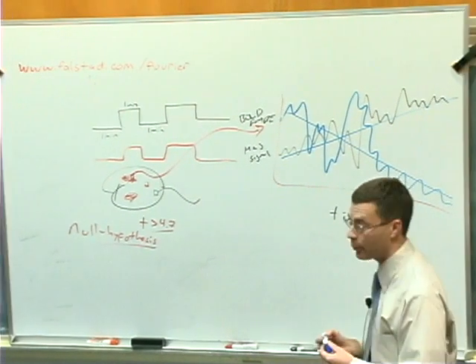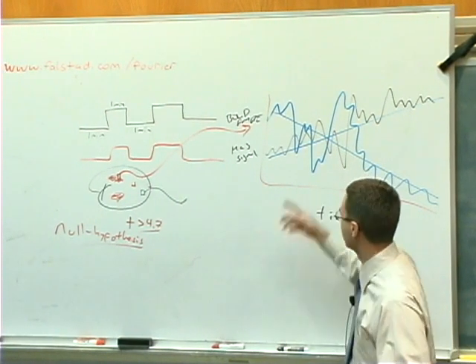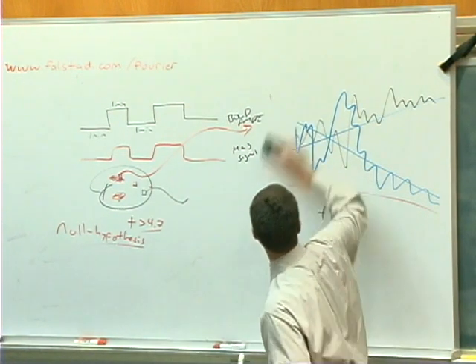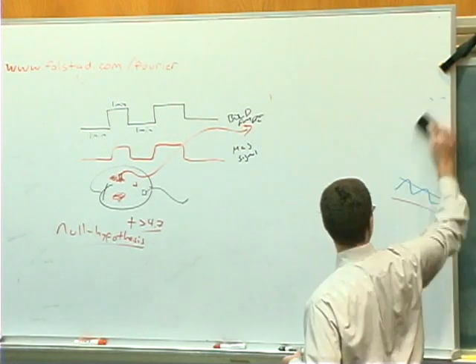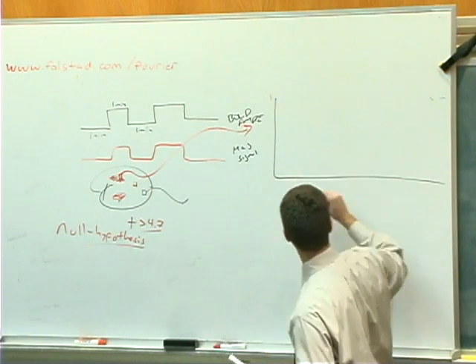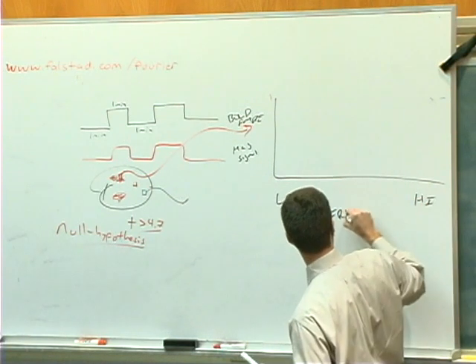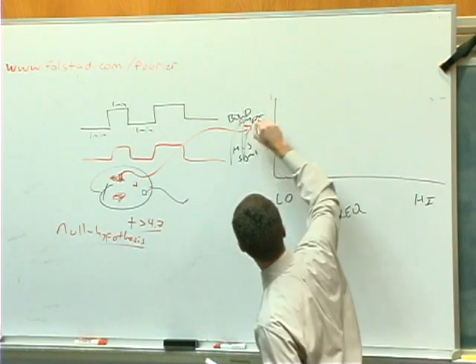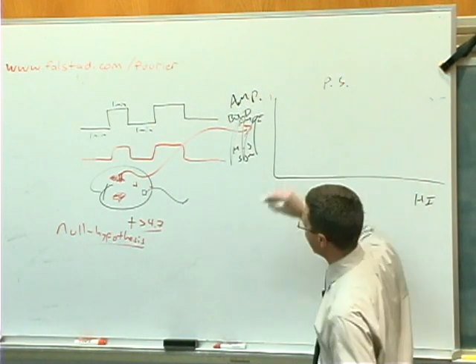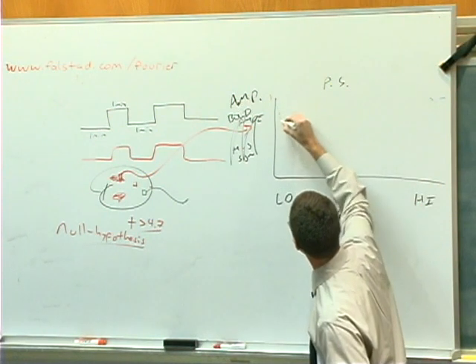Let's take a look at the power spectrum. We're kind of used to looking at power spectrums. Now let's look at the power spectrum of the time series data from each one of these voxels. So what would that look like? This is low frequencies, high frequencies, and this is amplitude. This is a power spectrum of the data from any one voxel over time. And what you find is it looks a little something like this.